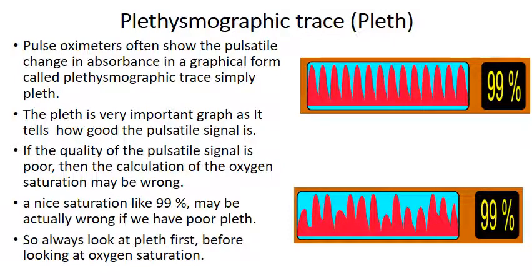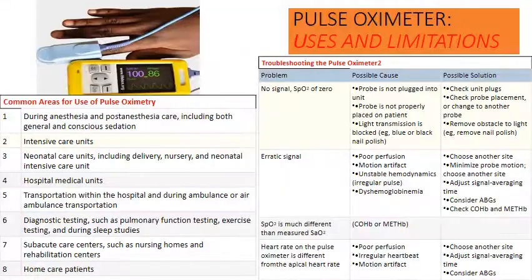Troubleshooting a pulse oximeter is pretty straightforward. If there's no signal, usually it's because the light is blocked or reduced in some way, so that the arterial blood systolic and diastolic levels are indistinguishable. And so it can be confused by certain types of fingernail polish.